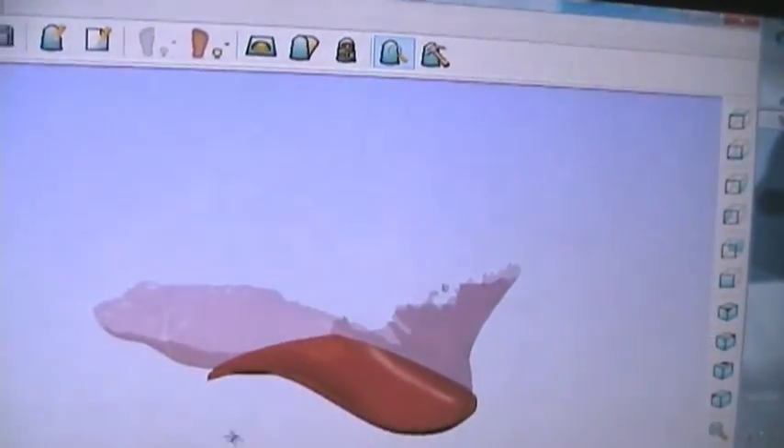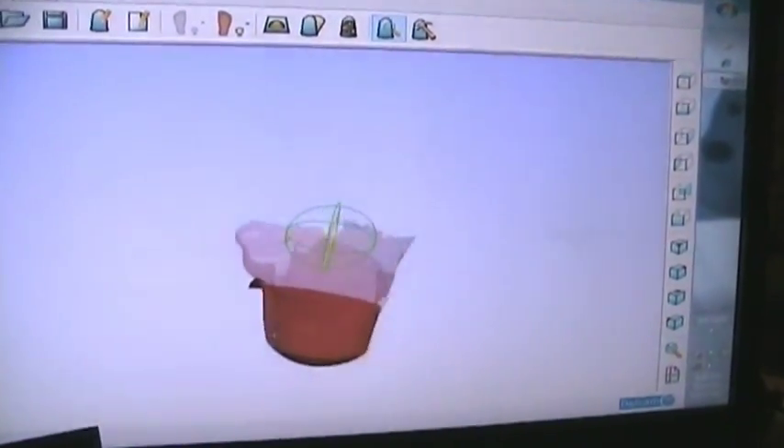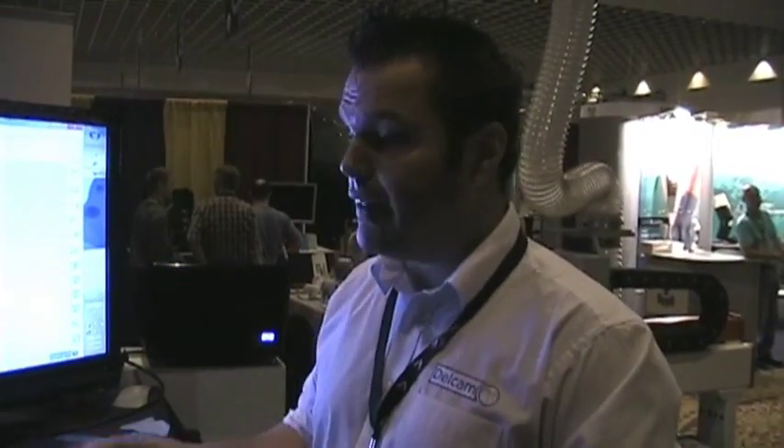Once we finish with the orthotic design, we'll be ready to send to the Patriot machine to be machined. The next step is to go through the OrthoMil interface to select the piece of material we're going to cut — either polypropylene, MDF, cork, etc. Then we select the orthotics that are going to be machined, and the software calculates the tool paths for us.